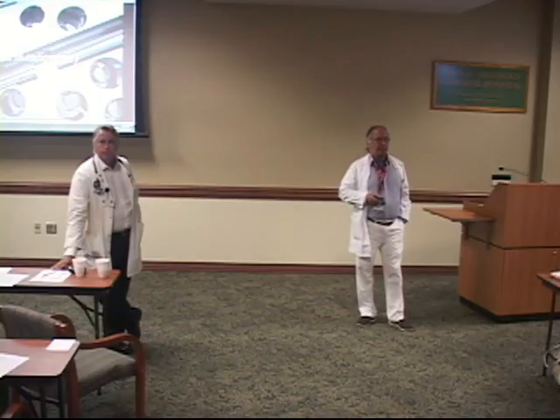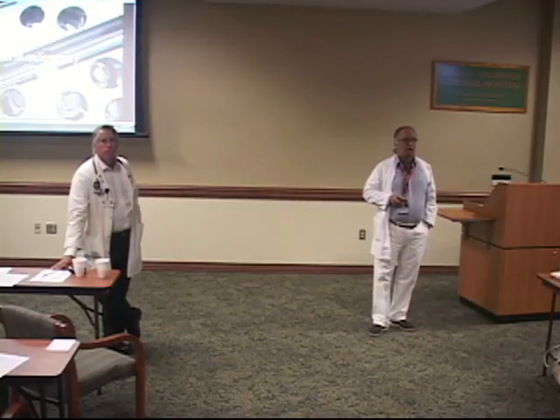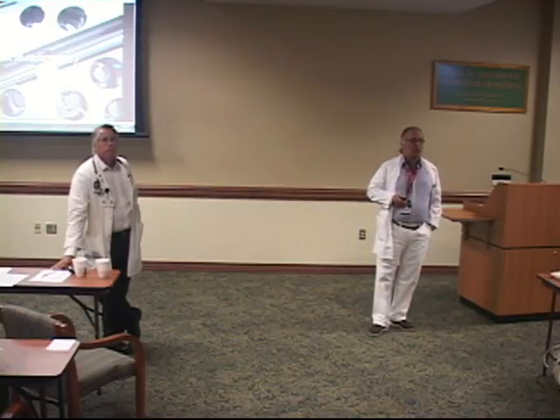Who determines if you have a tumor in the ear? Most of the ones we get, and we get about 8 per year, are picked up by ear, nose, and throat surgeons in the course of investigating hearing loss. They'll get an MRI and see it there and send it to us, and it's a great way to treat this tumor. Much, much easier than open surgery, and a lot safer and very effective.